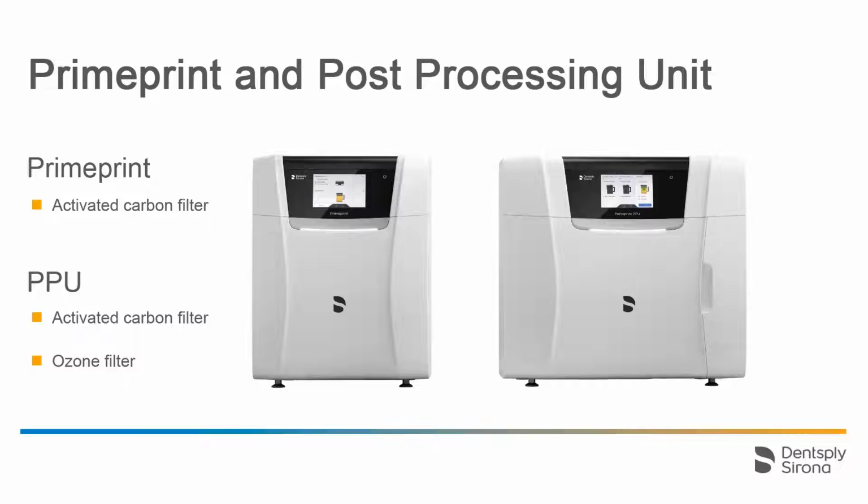Should there be a significantly increased odor nuisance from the activated charcoal filter, or the display prompts to change the filter, you can also perform the exchange yourself. An ozone filter is also installed in the post-processing unit. Here, too, you will receive a message on the device's display as soon as it needs to be replaced.